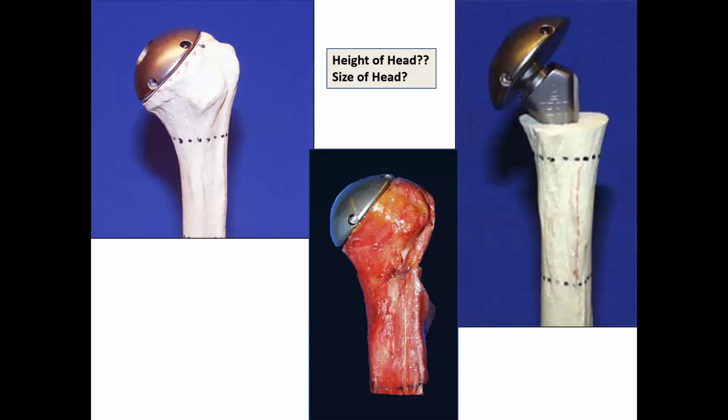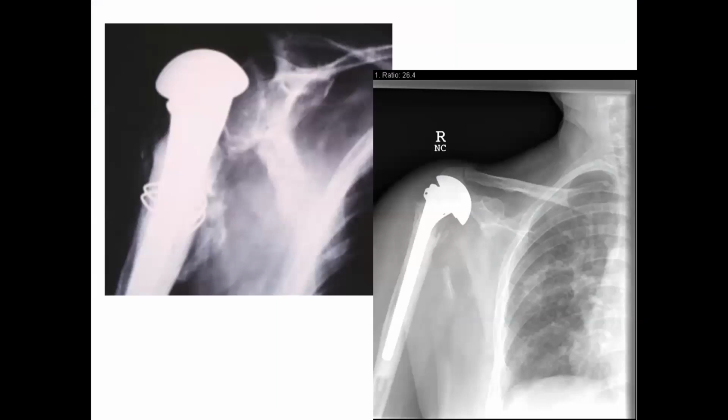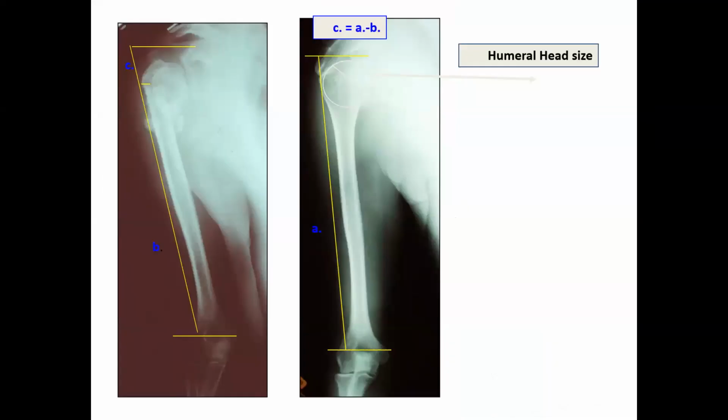And it's very important to determine the height of the head and the size of the head. Usually the complications that we see in such cases are due to poor planning preoperatively. So as you can see in these x-rays, we have poor healing of both tuberosities and upward migration of the prosthesis. And it impinges the acromion, as you can see, with failure and poor results. So it's very important to know the height of the stem when we place it.